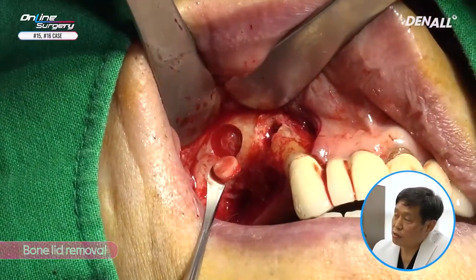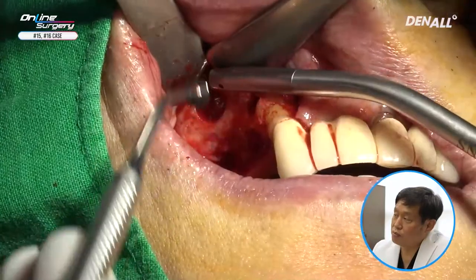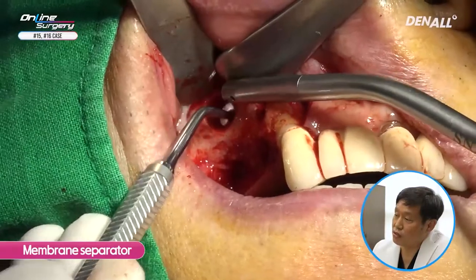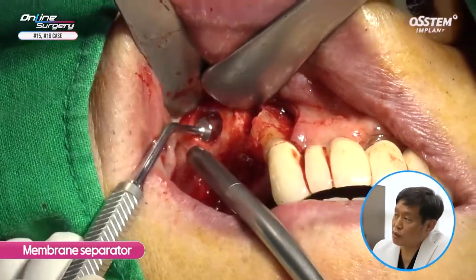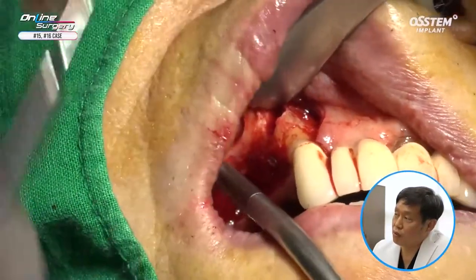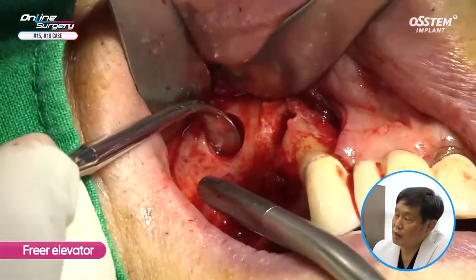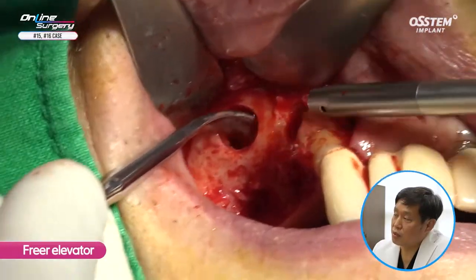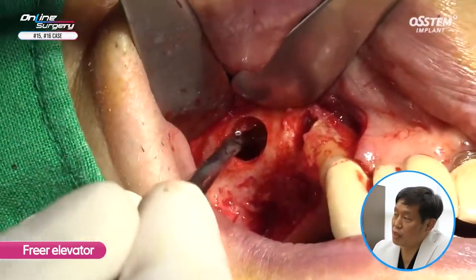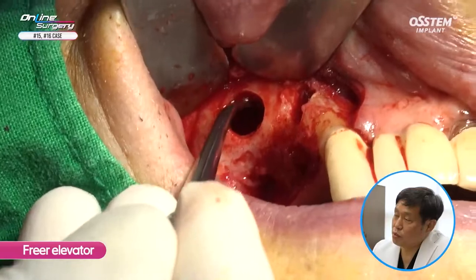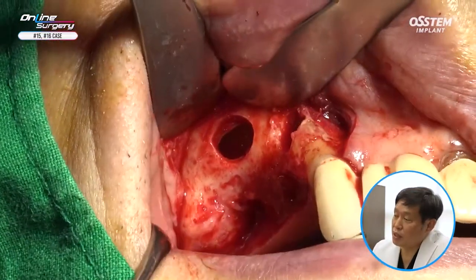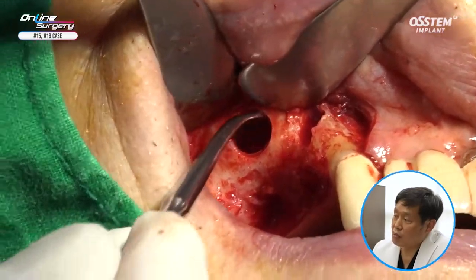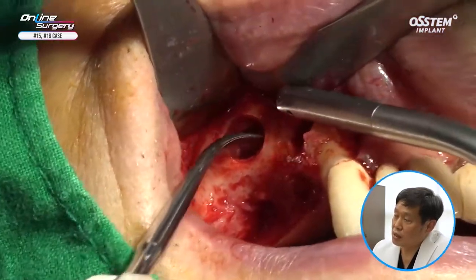A Freer elevator is used to remove the bone lid. You can see the sinus mucosa moving. A membrane separator is being used to detach it. A Freer elevator is used to elevate the sinus membrane. Mucosal thickening was quite severe in the case of this patient, so you can see sinus membrane perforation.